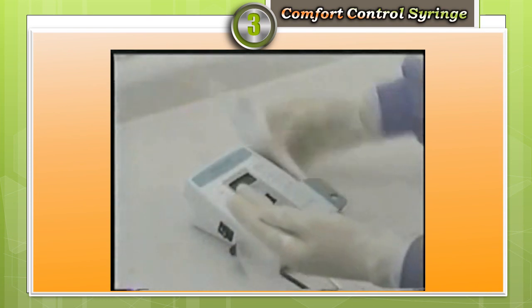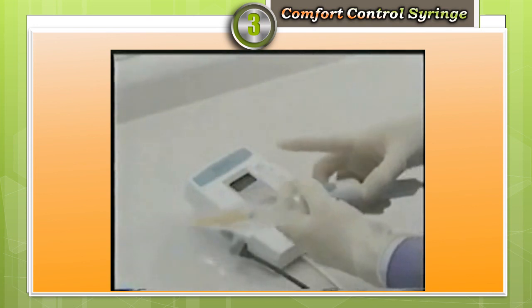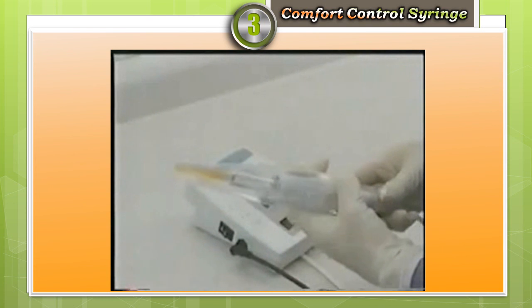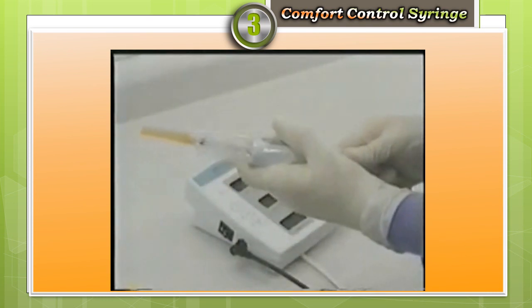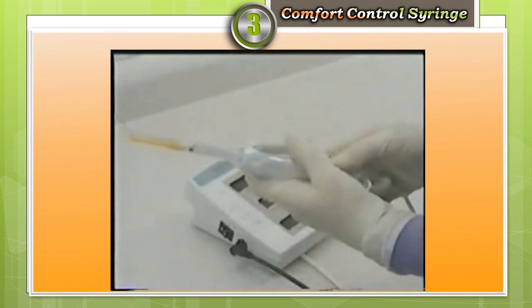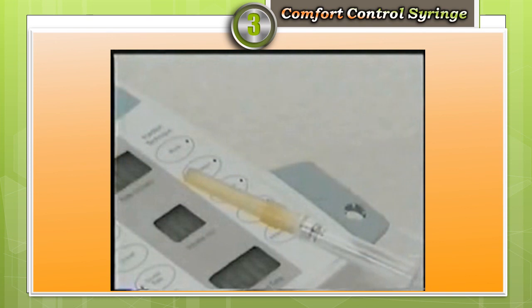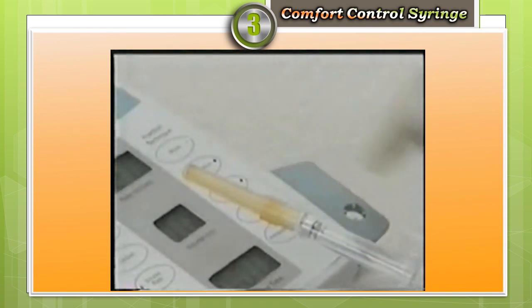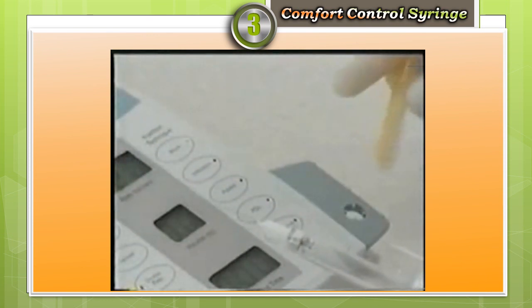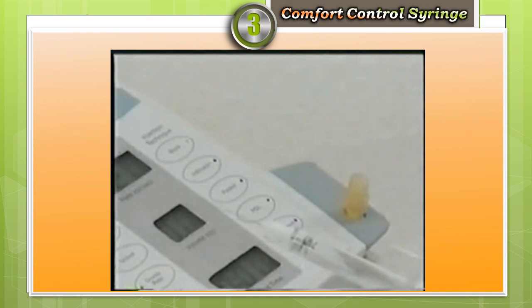Before the injection, Midwest recommends that you cover the handpiece with a disposable sleeve, as is typically used to cover dental low-speed motors and air-water syringes. Pull it down past the cartridge sheath so it covers the handpiece but does not obscure the anesthetic cartridge. Select the appropriate injection type. Remove needle cap. If your CCS is located on a counter, use the recap station located on the handpiece holder. If wall-mounted, use your standard recap station.